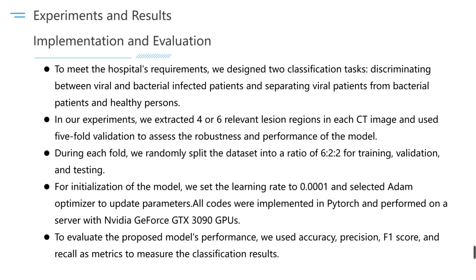In our experiments, we extracted 4 or 6 relevant lesion regions in each CT image and used five-fold validation to assess the robustness and performance of the model.